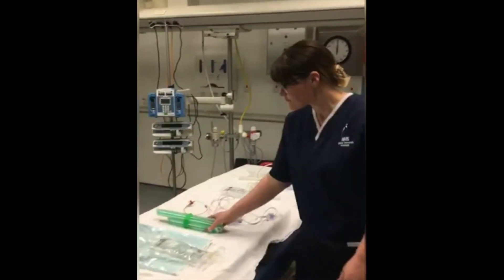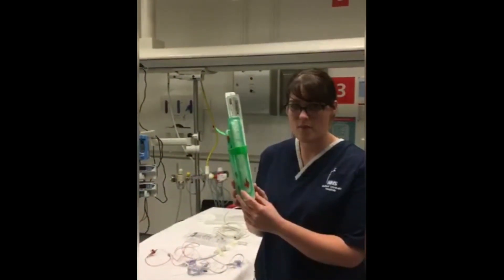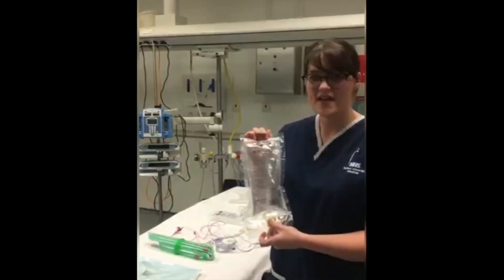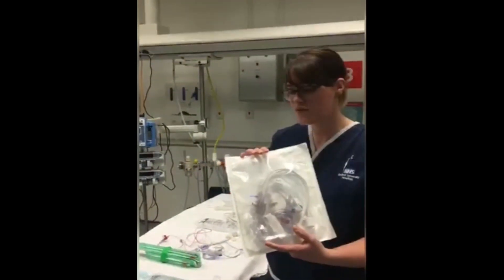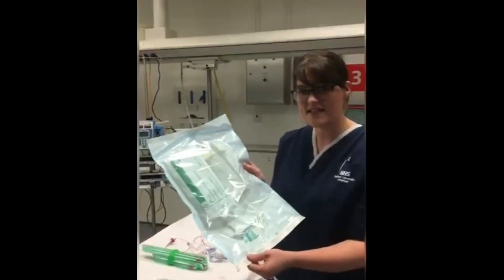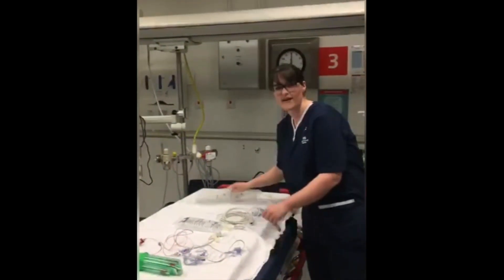The equipment you will need includes long and short art lines for radial or femoral lines, a 500ml bag of normal saline, your art line cables, an equipment kit with everything you need, a transducer cable, and a pressure bag.